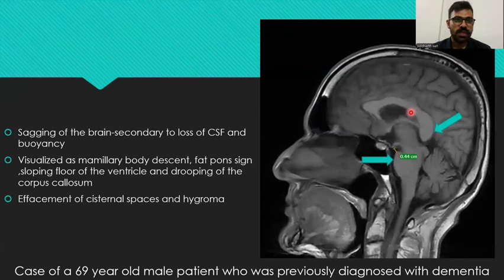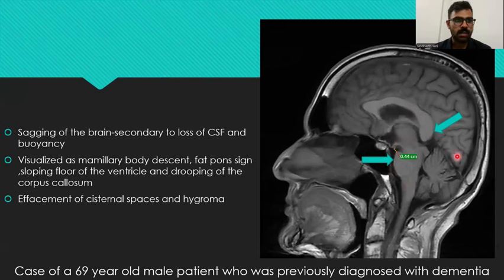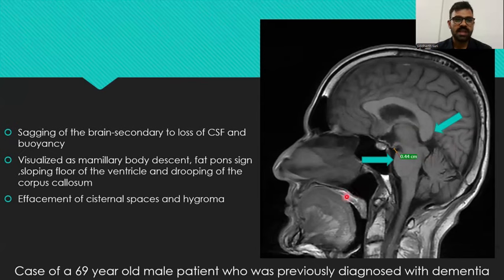Sagging of the brain, secondary to the loss of CSF and buoyancy, is visualized as mammillary body descent, the fat pons sign, sloping of the ventricle, and drooping of the corpus callosum as depicted here. Effacement of cisternal spaces and subdural hygromas may also be seen. This is demonstrated in a case of a 69-year-old male patient previously diagnosed with dementia.